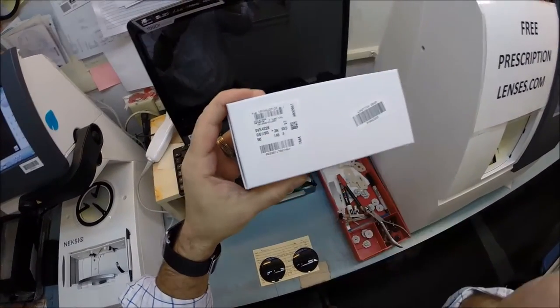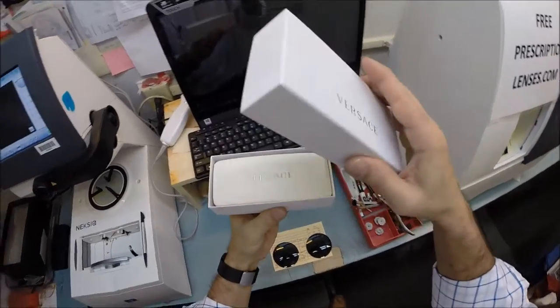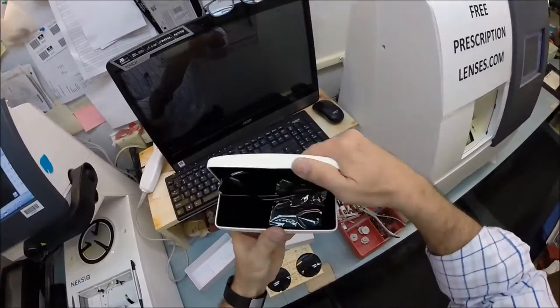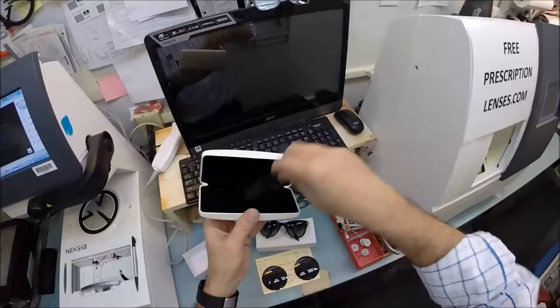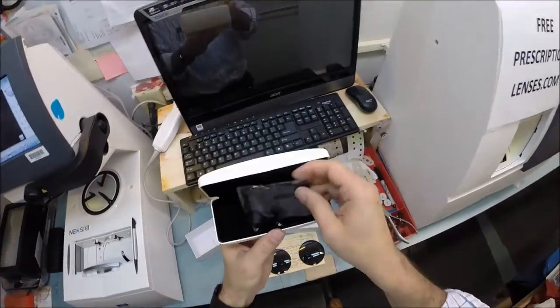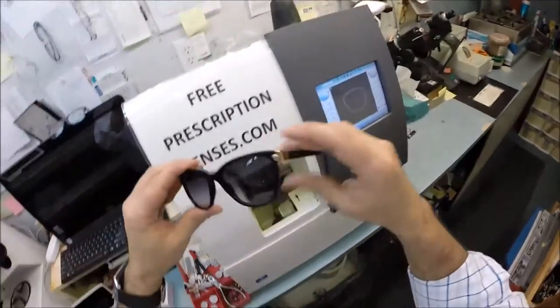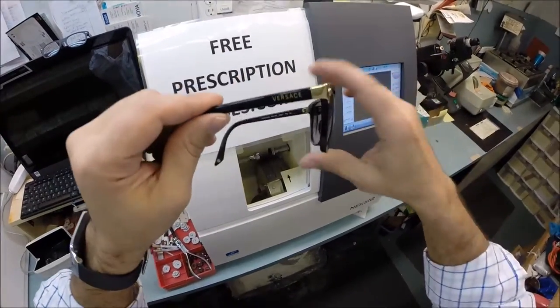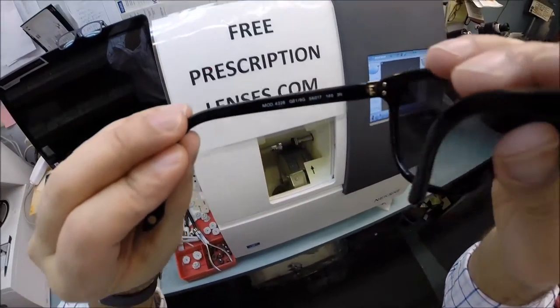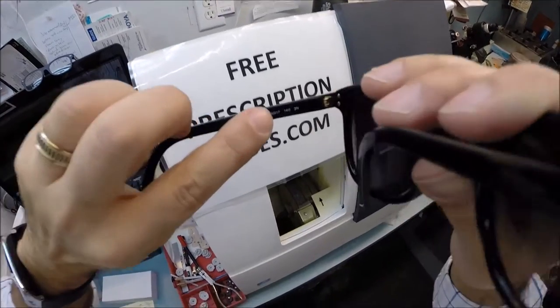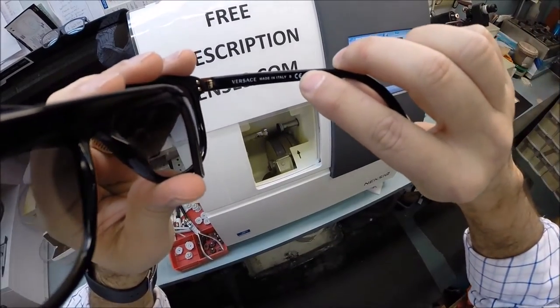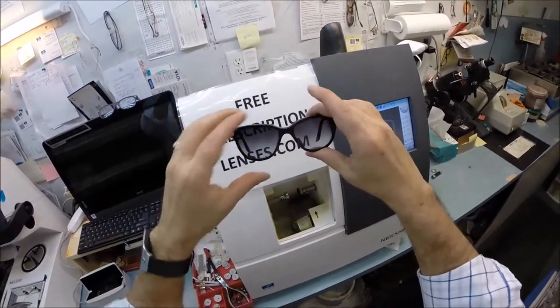This is the Versace box it comes in, your Versace case, card of authenticity, and your frame with the cleaning cloth. The frame has the Medusa up front on each side and the classic lettering Versace on each side. This is model 4228 color GB1 in the 56 eye size with the 17 bridge, made in Italy.